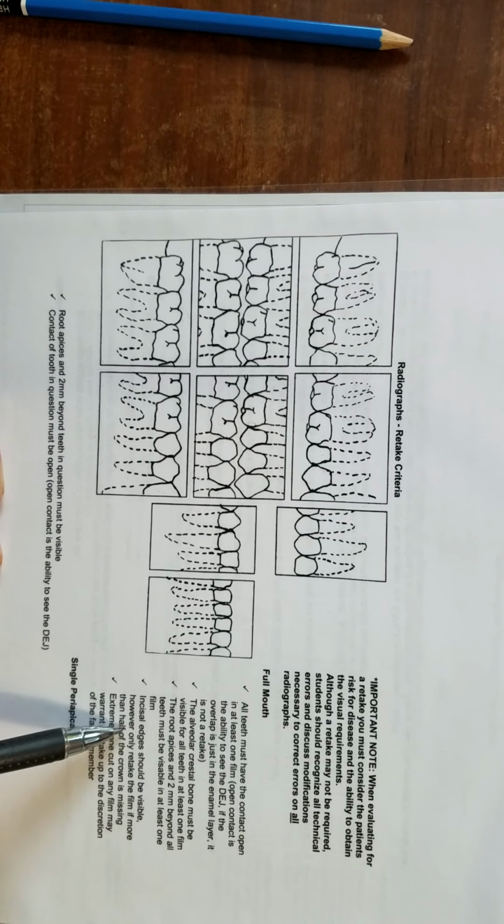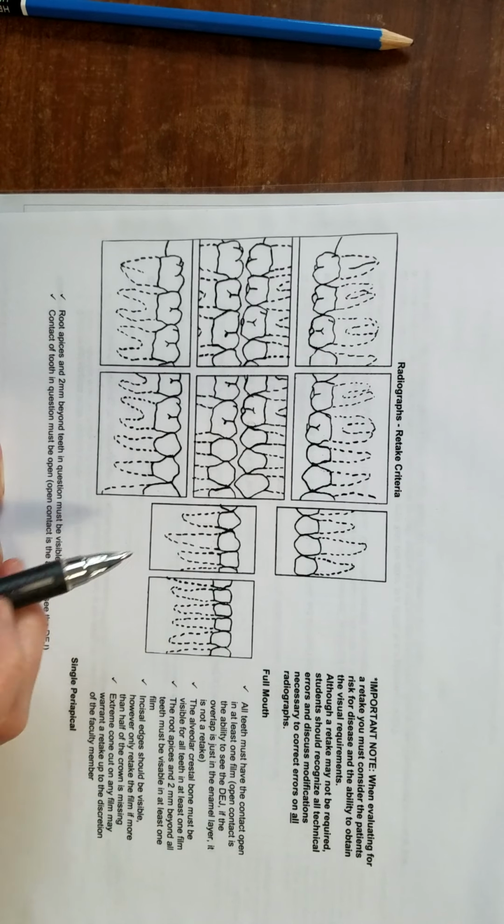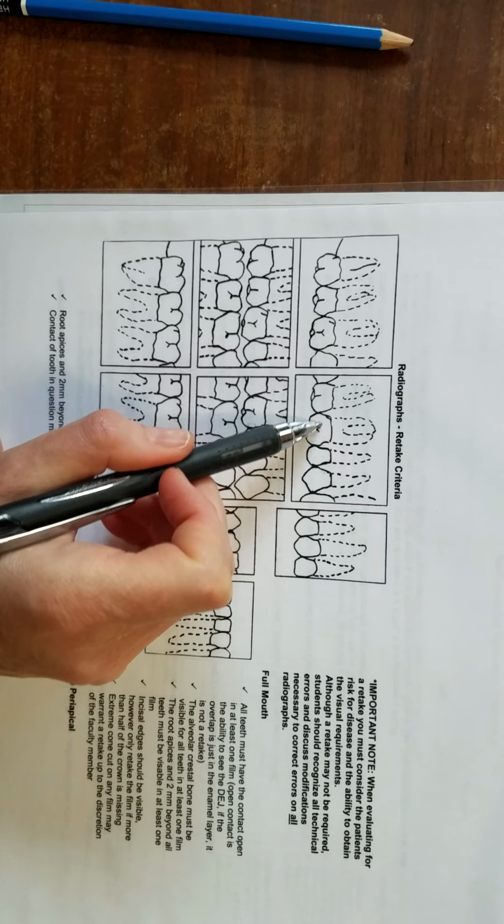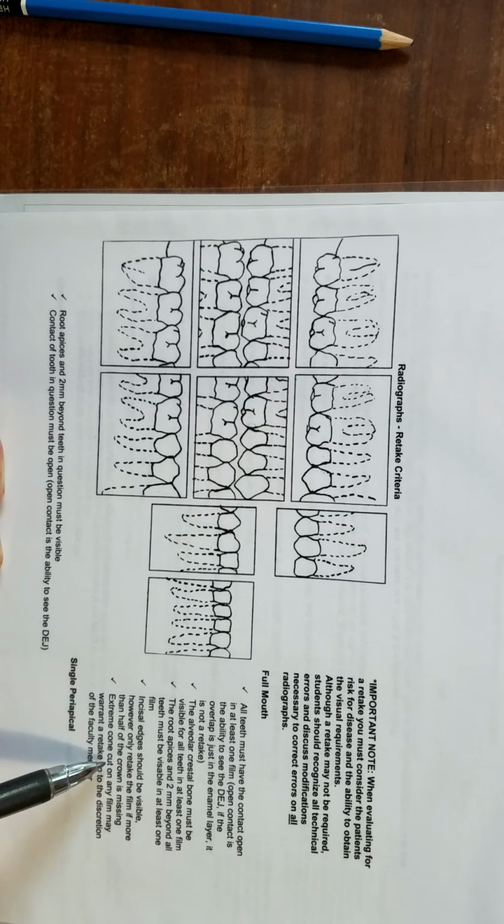Incisal edges should be visible, however, only retake the film if more than half the crown is missing. So if it's just the tips, the cusps, that's okay. If it's into half the crown, you retake it.